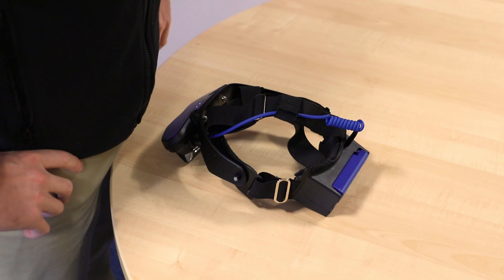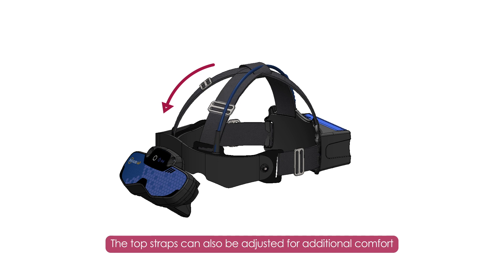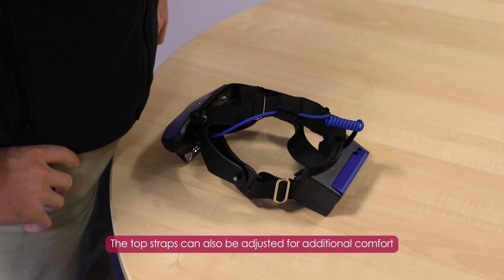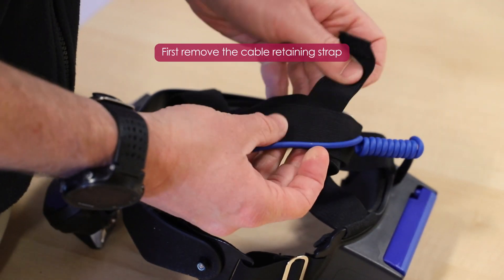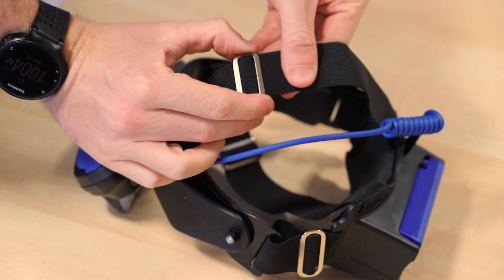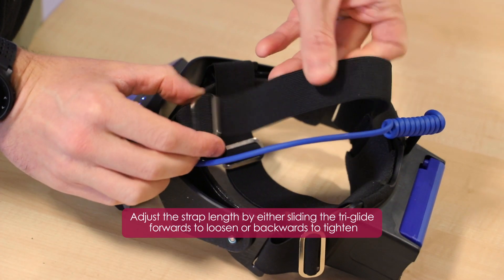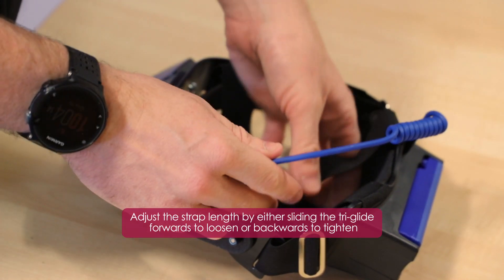Finally, for additional comfort and image stability, the top straps can also be adjusted. This is done by first removing the cable retaining strap, then adjusting the strap length by either sliding the triglide forwards to loosen the fit and backwards to tighten.